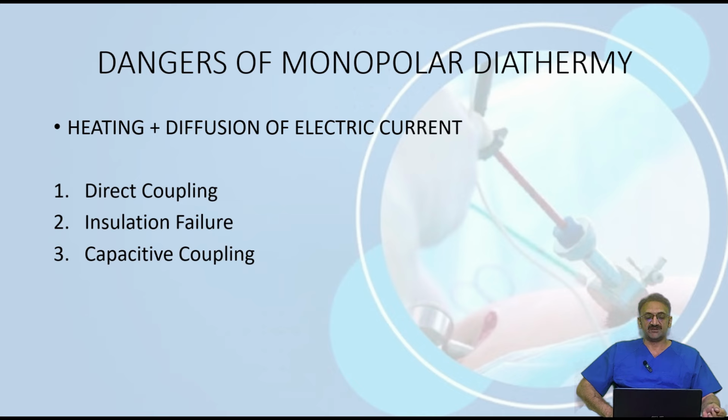Monopolar diathermy is really very cheap to use. It is available everywhere. For laparoscopy, you'll have to have just the cord which is used for laparoscopic procedures. Otherwise, it is readily available and relatively cheap as well. However, it is not without dangers.